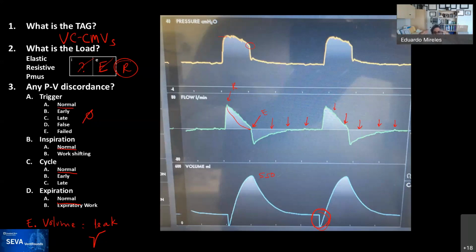But if you give volume control, the amount that it will inflate and the areas that will inflate will be affected because you're going to have a large amount leaking through the hole, and you're not going to be able to inflate the rest of the lung. So pressure control will give you a more even inflation. It's easier to control. They're both iffy because you don't know exactly what you're controlling, but it's easier to manage with the pressure control mode, especially if it's a positional leak, right? Which is a big problem in neonates, and maybe not so much in adults with a chest tube, but yeah.